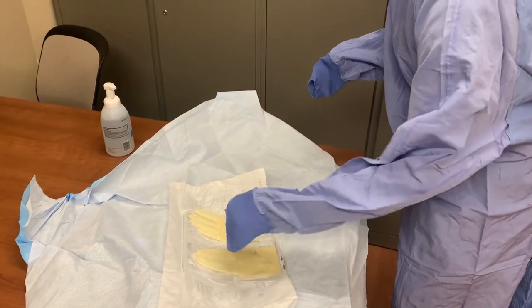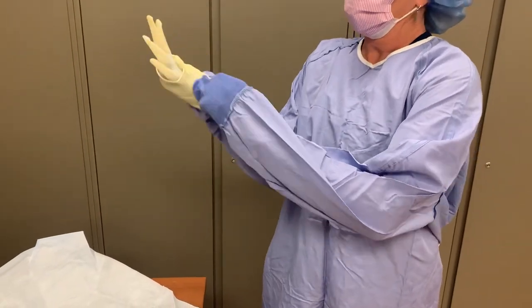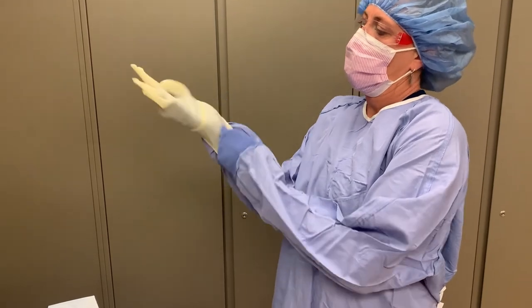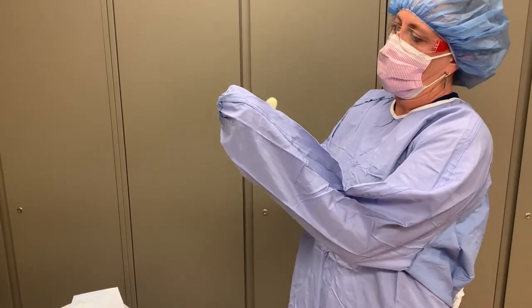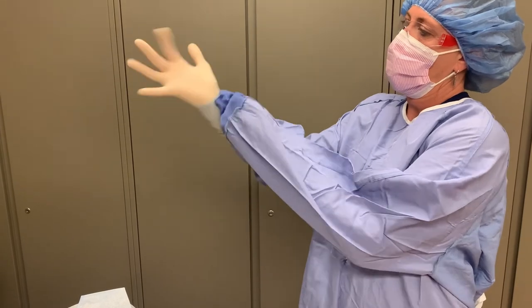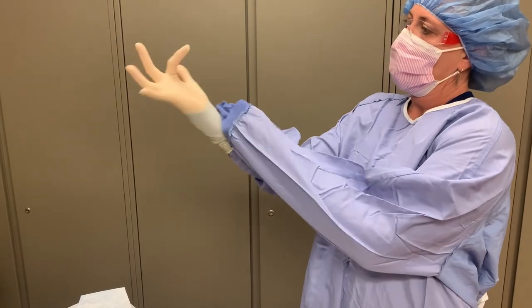Grasp one glove with the cuff of your gown and slide your opposite hand into the glove. Your hand must remain within the sleeve's cuff while applying the glove. The cuff will be completely contained underneath the glove. Then gently pull back on the gown sleeve — with the glove on top of the cuff, this will pull the glove further onto the hand and allow your fingers to begin to exit the sleeve and into the glove. Now you can continue to use your covered hand to manipulate the glove, pulling it over the sleeve and maneuvering your fingers into place.